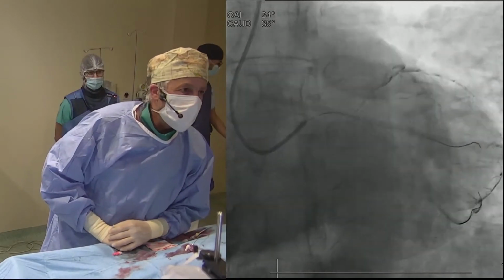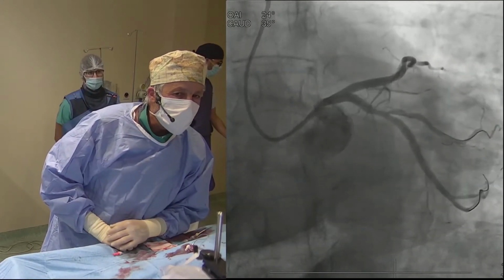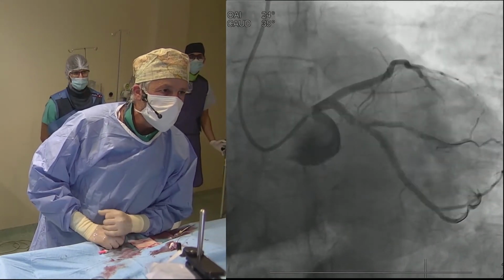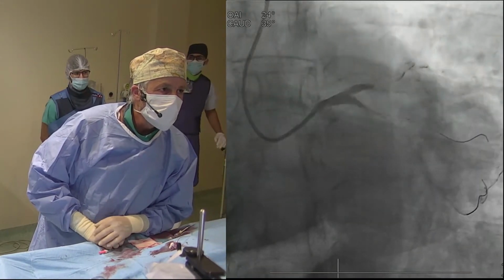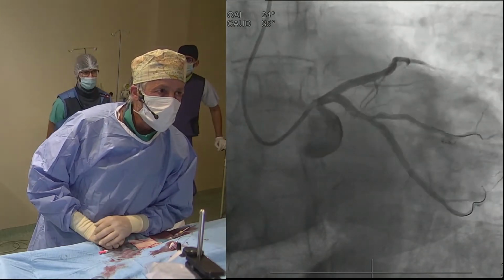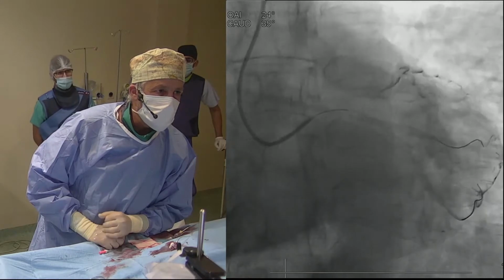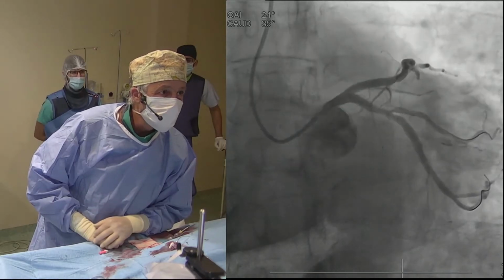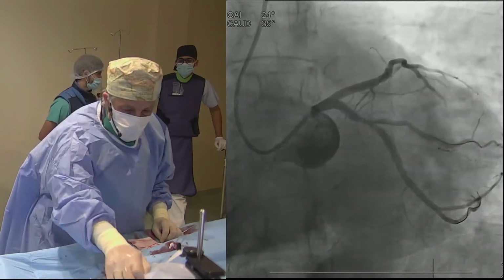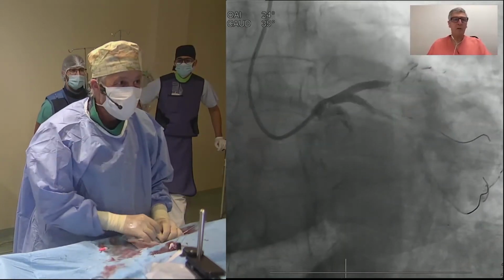I don't know what you think, Thierry, but when I don't see calcium, when I see an unstable plaque, I don't pre-dilate with a 1:1. I sometimes go a bit smaller, particularly in unstable lesions, very fatty lesions, in bifurcations, in order to prevent maybe a dissection that is going to make you implant much longer stents. What do you think? Yeah. Oh, yeah. I fully agree with you.